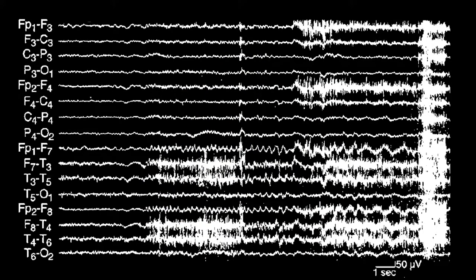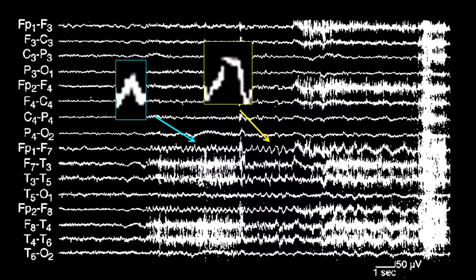As you can see, initially, in the event, the waves of which I am signaling one out are triangular. Further along the run, a wave looked notched. In addition, it is wider than the prior selected wave, but still the shape of the original wave is not greatly distorted.